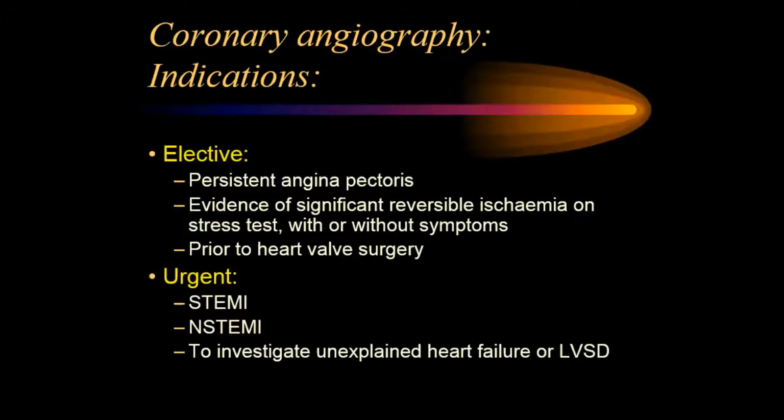And of course, we would do angiography prior to considering valve replacement surgery or any form of cardiac surgery, meaning non-coronary surgery. If anybody's having, for example, an aortic valve replacement, we would need to do an angiogram beforehand to ensure there's no coronary disease to necessitate a bypass operation along with the valve replacement.